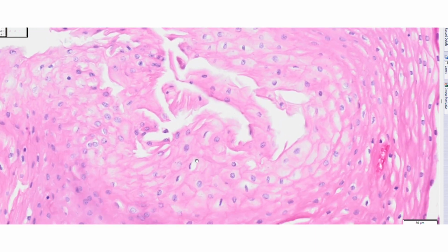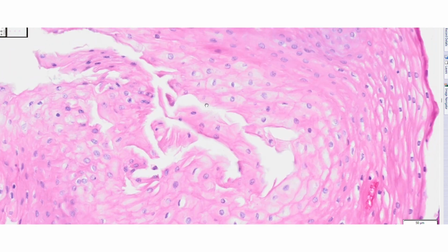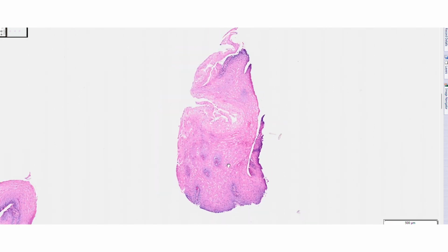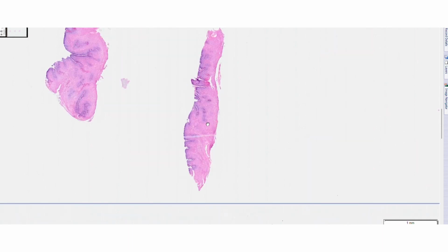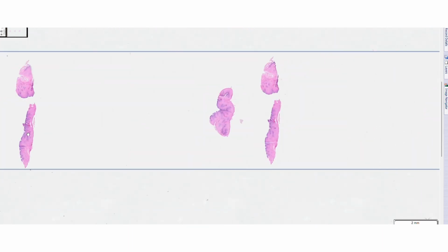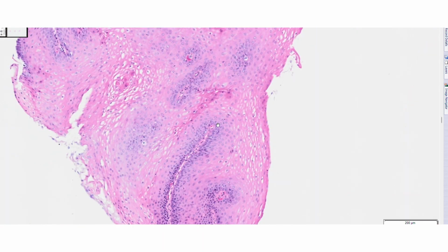And it still has all of the same abnormal looking nuclei, but more importantly, I need to show you that all of these areas here, which are hypereosinophilic, are embedded parasitic worms. And I will show you the diagnostic.